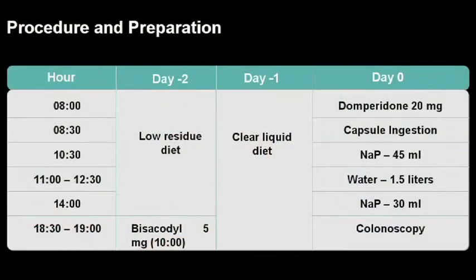The method used was a single-blind prospective comparative study, in which up to this date we have included 22 patients, 6 females and 16 males, with an average age of 46 plus or minus 12 years, with diagnosis of ulcerative colitis confirmed by biopsy. All patients were first subjected to a colon capsule endoscopy and after 10 hours to a colonoscopy with conscious sedation, midazolam 2 to 5 milligrams intravenous.